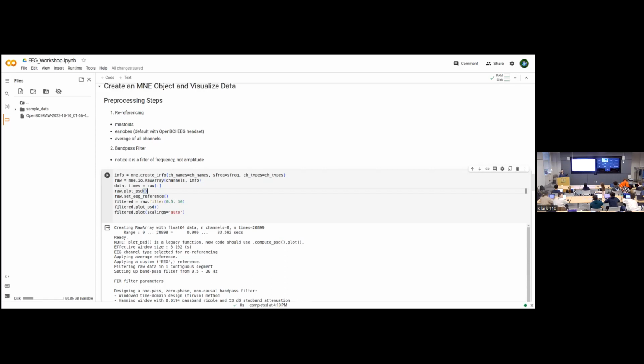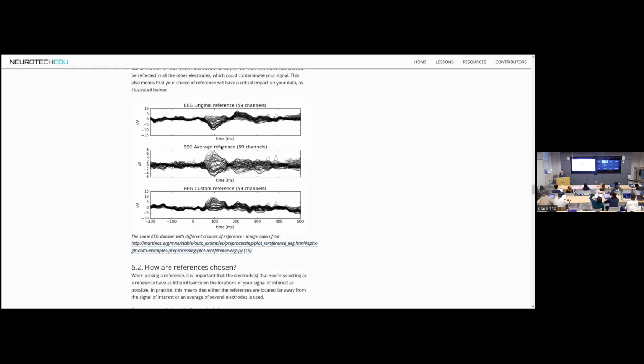Yeah, definitely. Re-referencing is basically like selecting a new ground for your signal, so that you adjust all of them by the same amount, so that you get them all onto the same scale once again. You can probably also understand it as centering in this case. I can show a graph actually. So would you say this is kind of the same as centering that you're doing?